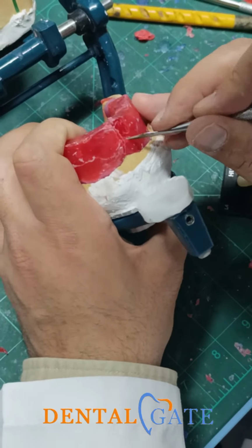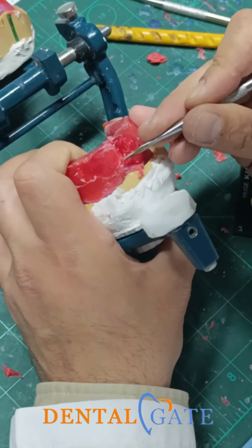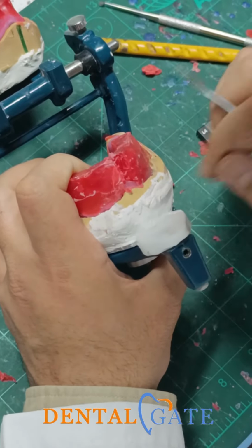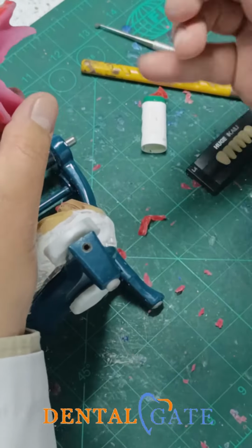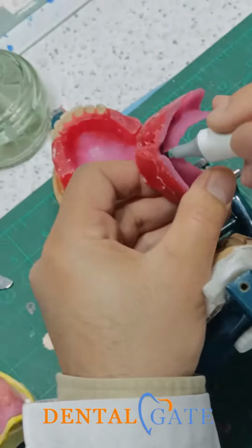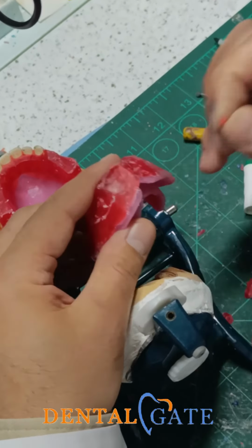Remove the wax here, and be sure the crest of the ridge is clarified in the wax to avoid putting the tooth outside of the ridge. And you can make an evaluation here. Sometimes I prefer to put my line here, and I follow this line to avoid going outside the ridge.